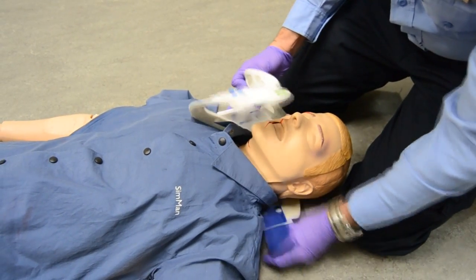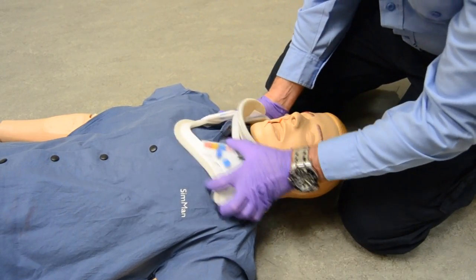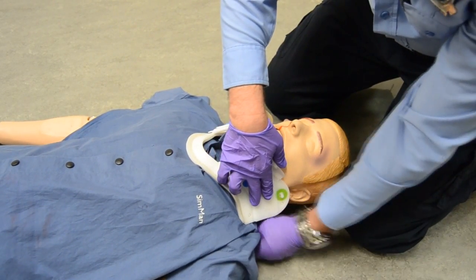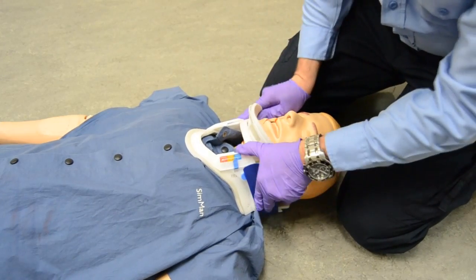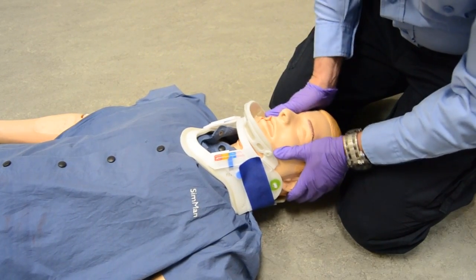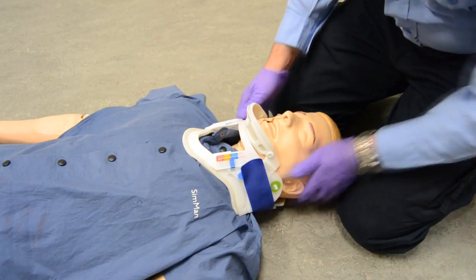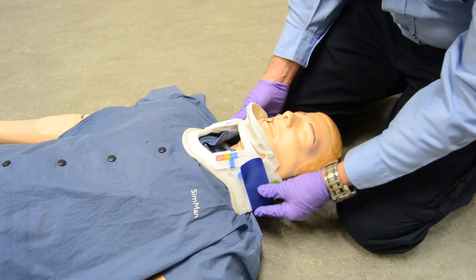Someone's holding C-spine, we come underneath, making sure that we get under the chin, and we secure it in place. We want to make sure that the head is not moving up and down. This should brace right on the sternum of the chest with no movement, so you can visualize that your patient is not able to move their head at all.